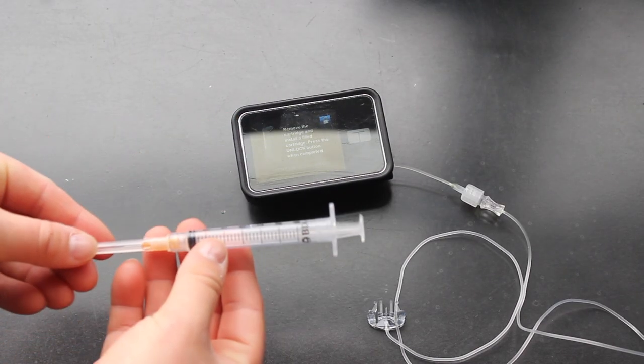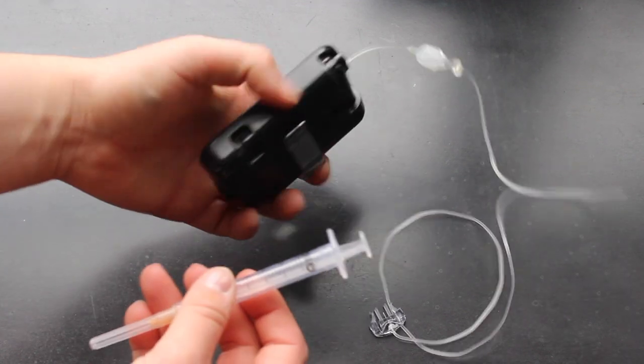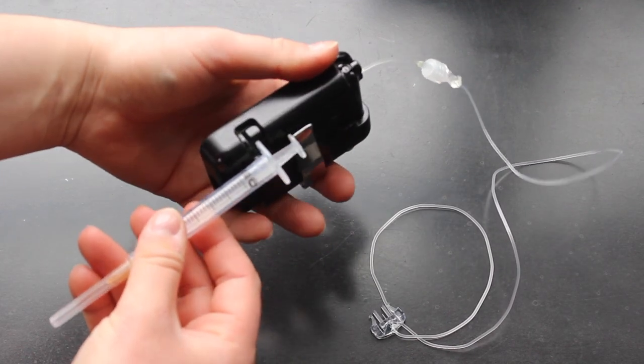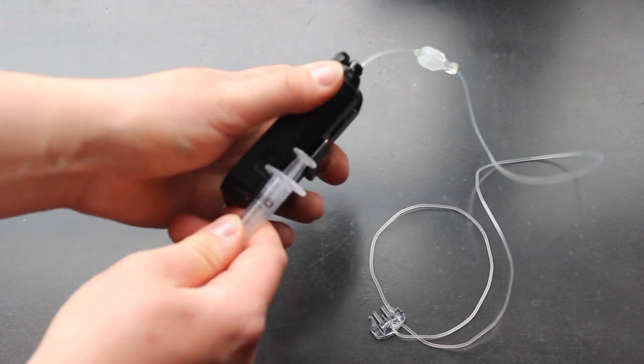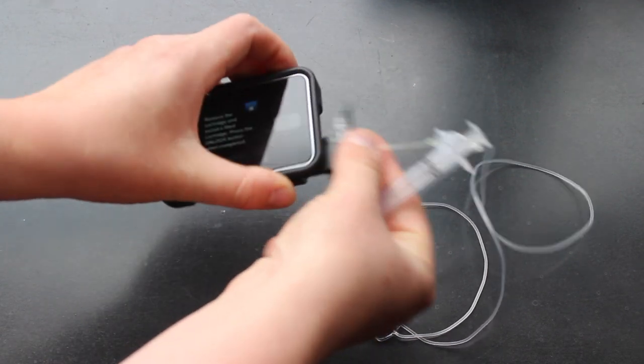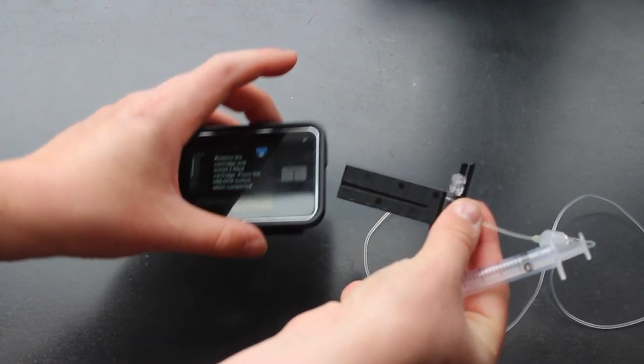To take the old cartridge out, I like to use this little trick, which is to use the back of the syringe to slide into this little slot where you can press and pop out the old cartridge.